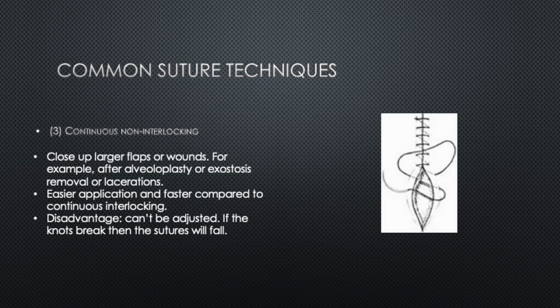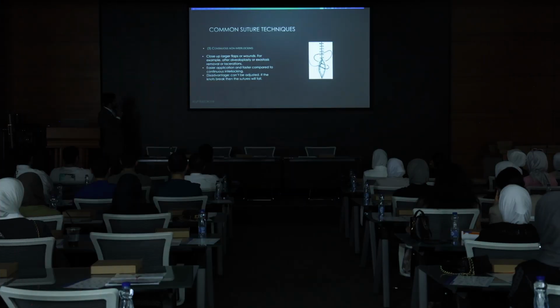It's used mostly whenever you have a long or large laceration or wound, and procedures like alveoloplasties or torus removal. Easier application and faster than interlocking, because whenever you do interlocking, you have to lock it every time you enter the wound. Disadvantages: it cannot be adjusted after it's placed, and whenever the knot breaks, the whole thing is going to fall.